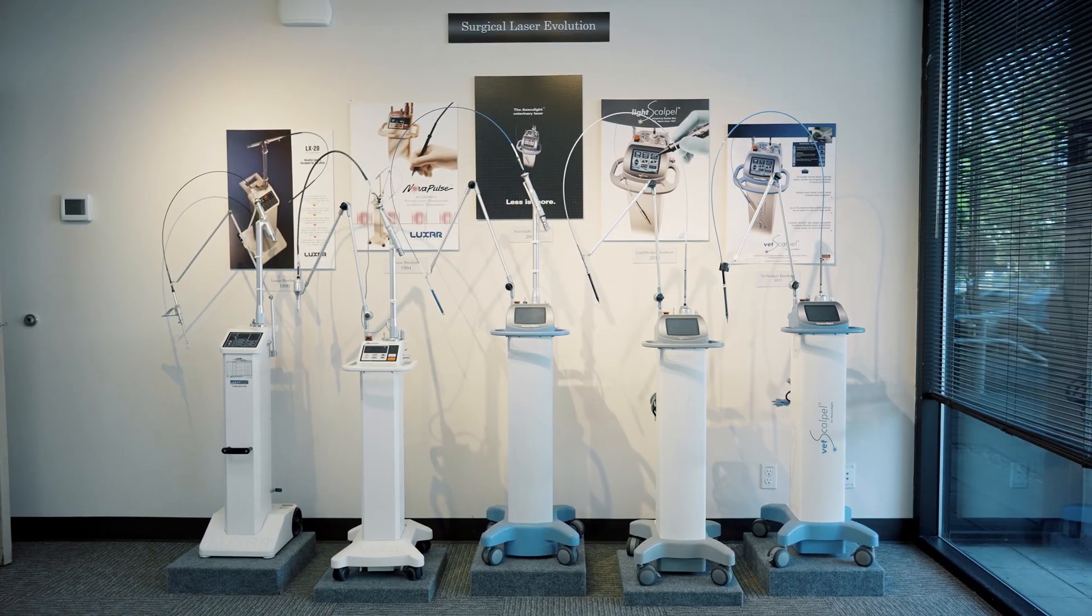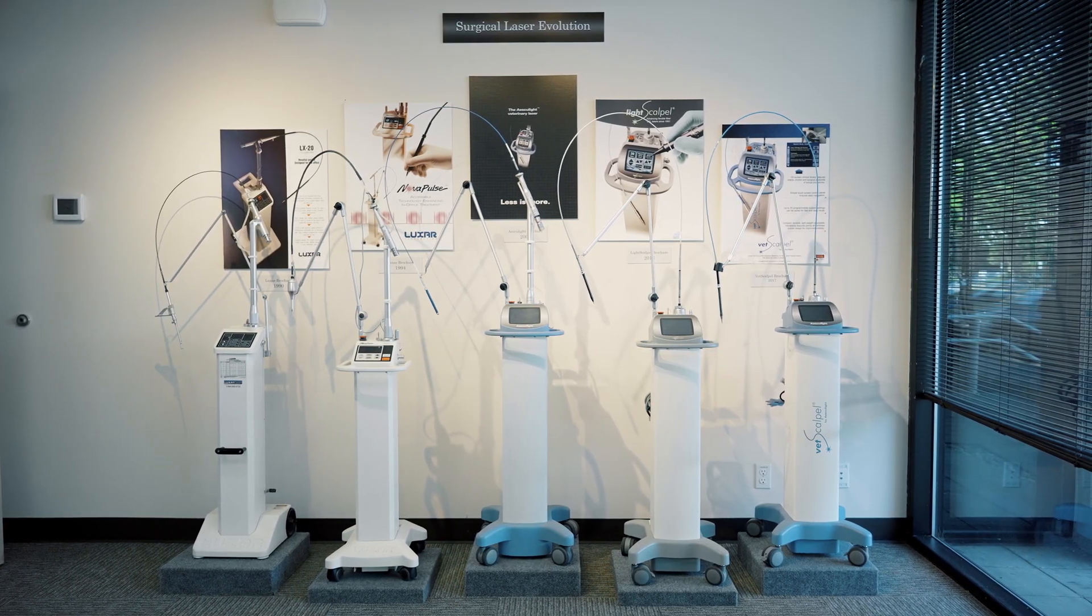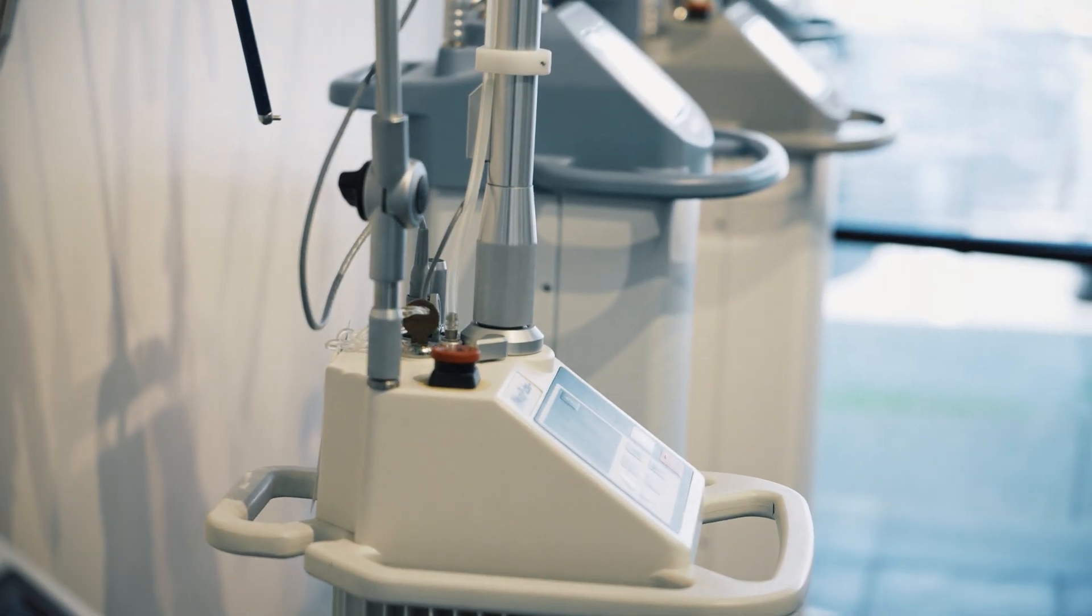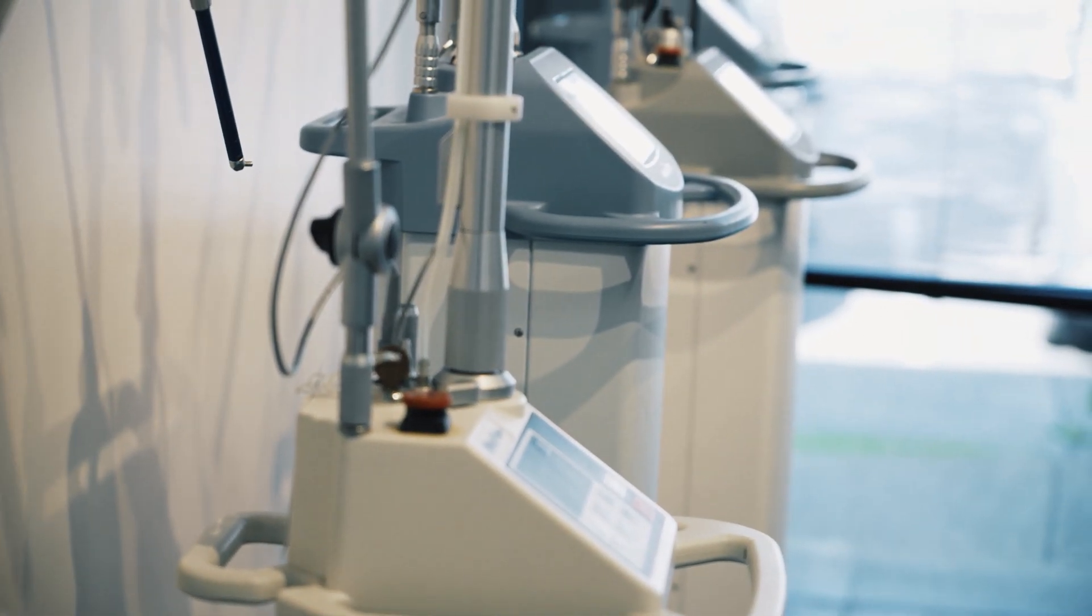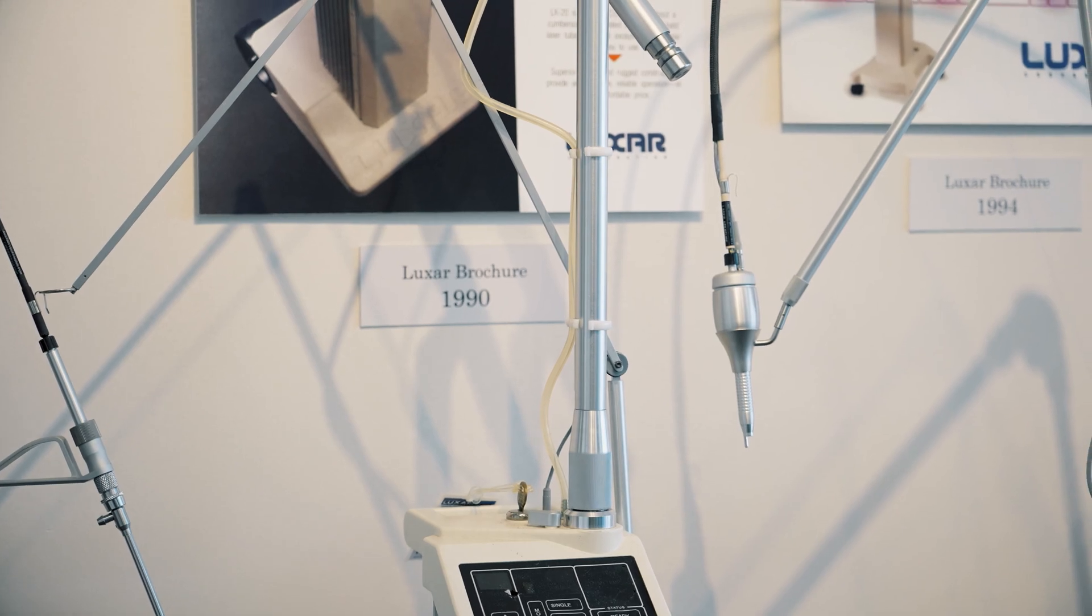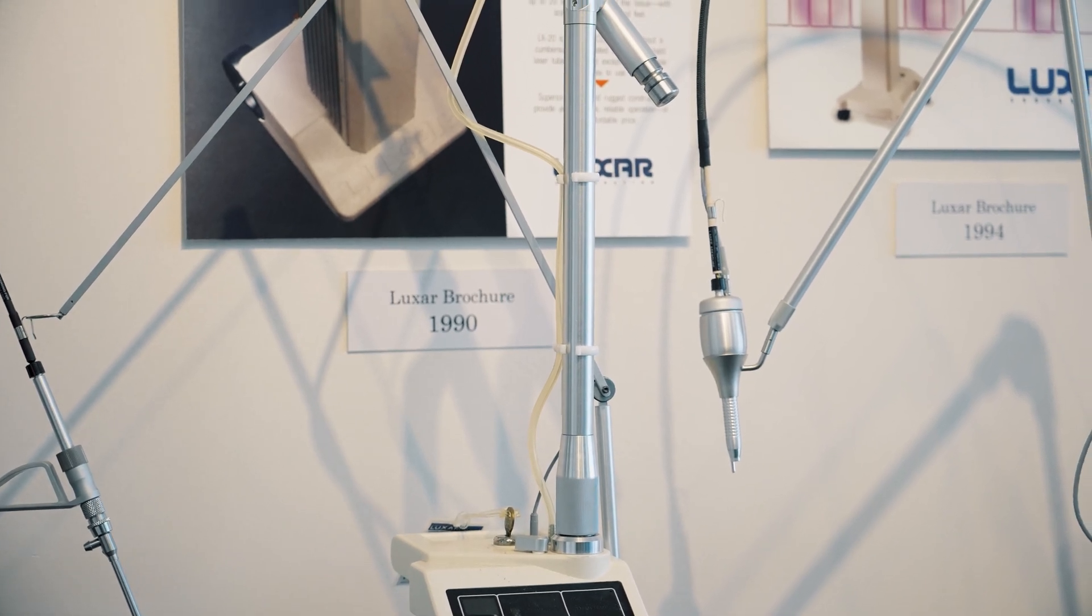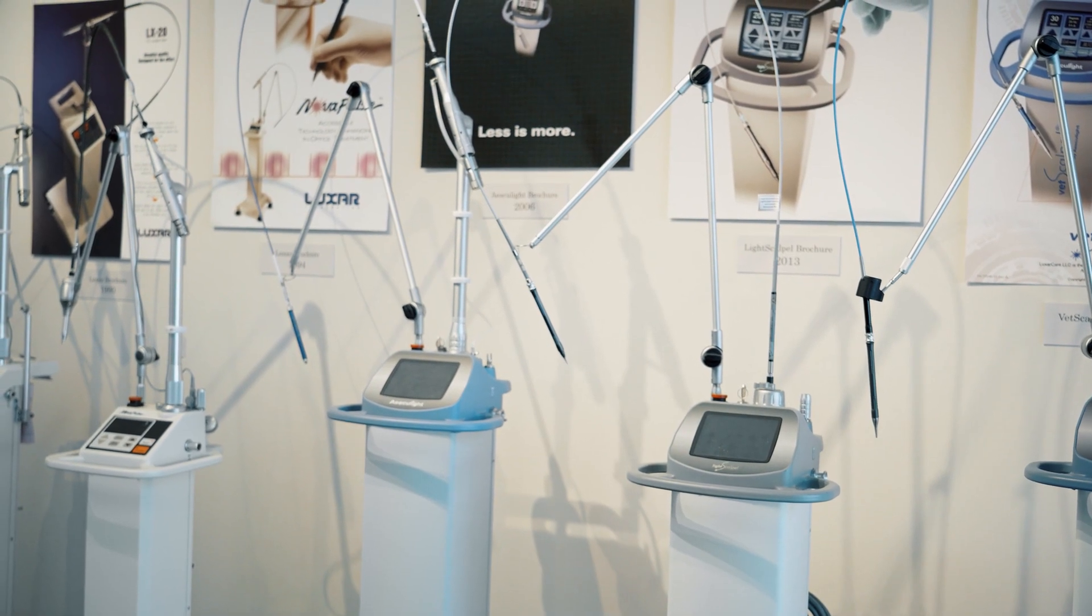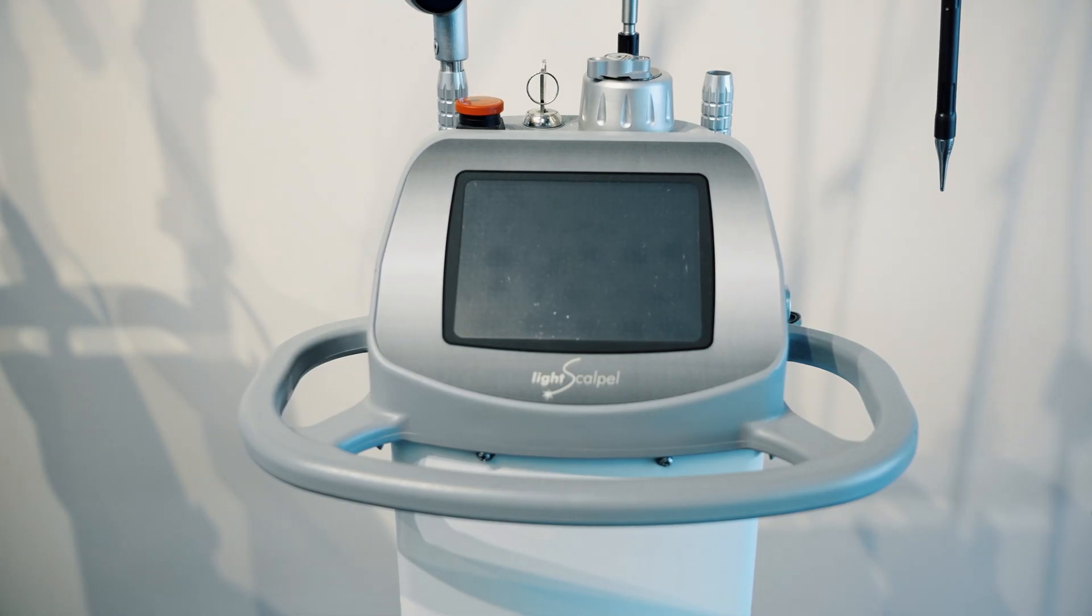Making the laser the standard of care is important for us because we believe that the laser does provide not only a better technique and tool for the doctors, but it does provide for an increase in better patient care.